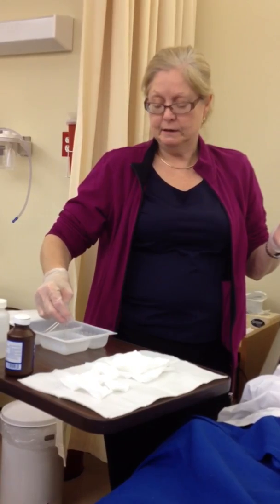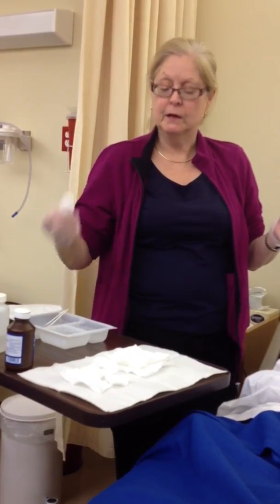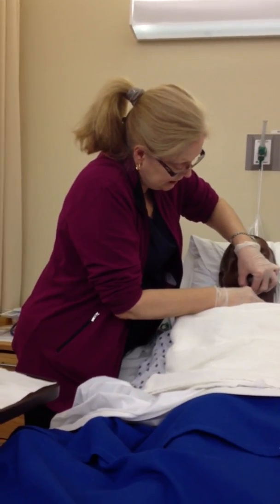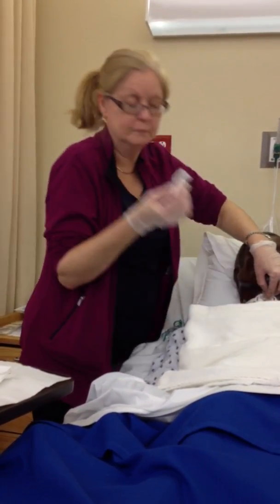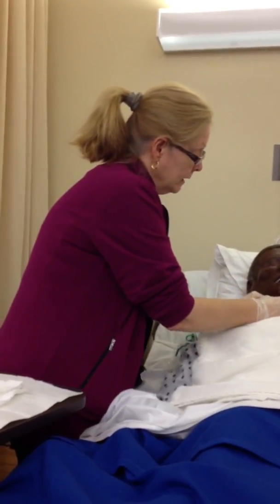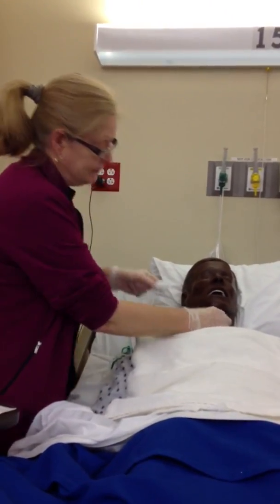And I'm wetting one of my gauzes here, and I'm going to take my gauze, and now I'm going to come under the cuff here, and I'm rinsing off that 50% hydrogen peroxide, because it can't stay on the skin. And then I flipped it over on the other side, and I'm coming here, and I'm doing the same thing, one swipe, okay? So that's done, and now I've washed it, I've rinsed it, so now what comes next?